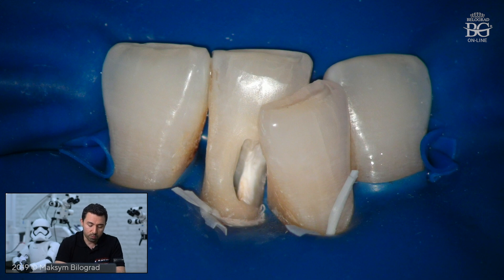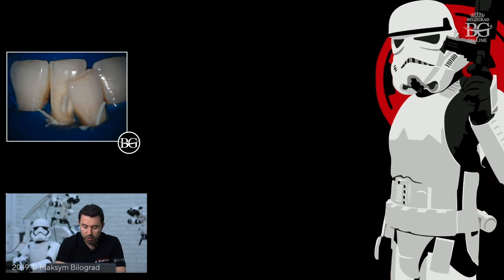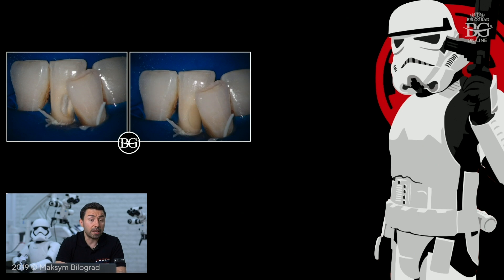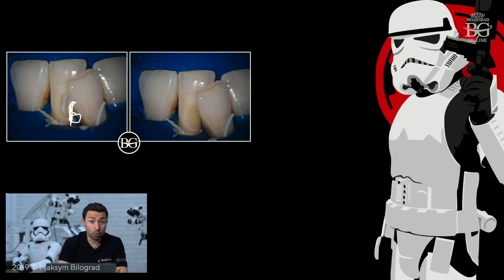We started the restorative plan with direct composite restoration. Since we preserved a lot of tooth structure, we can easily do direct composite here. The big problem during restoration was that we were not able to place a wedge or matrix, because the defect was super deep. If I placed any wedge, the matrix would be driven inside the defect, creating a reverse contact — which is not good due to food impaction and calculus development.